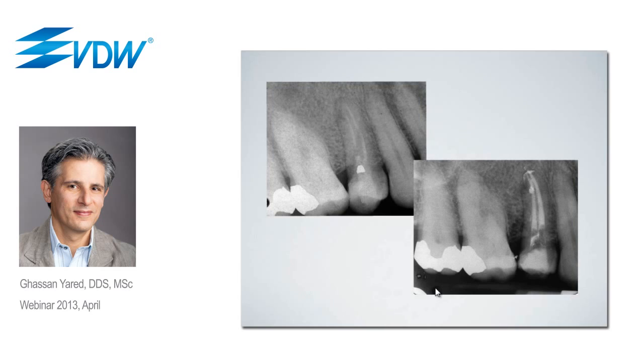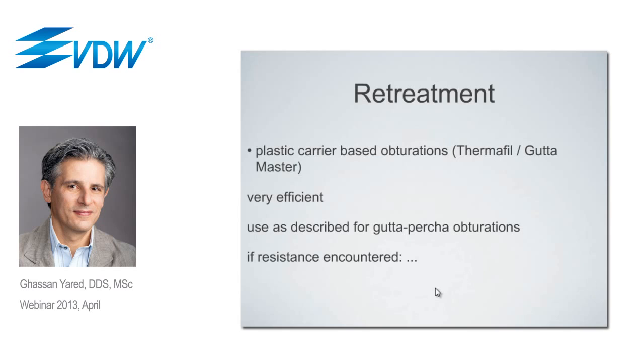This is a retreatment case that was started with the R25 and finished with the R40.